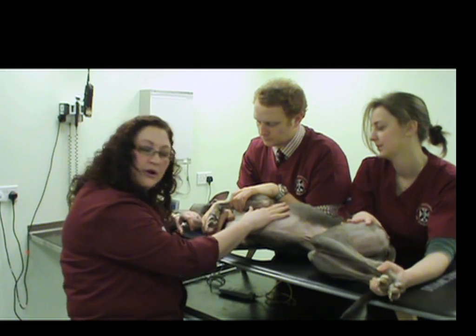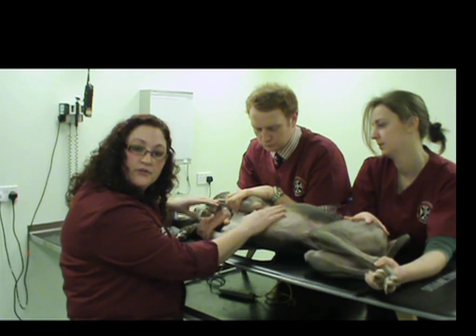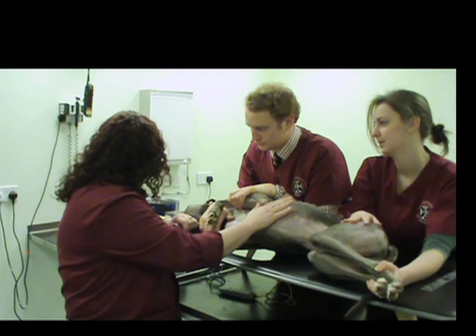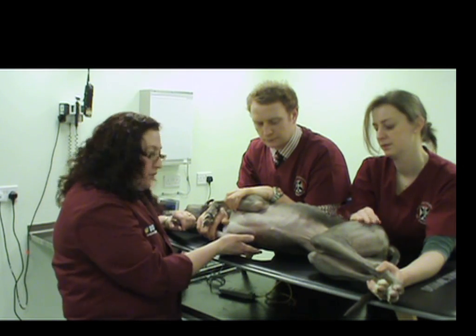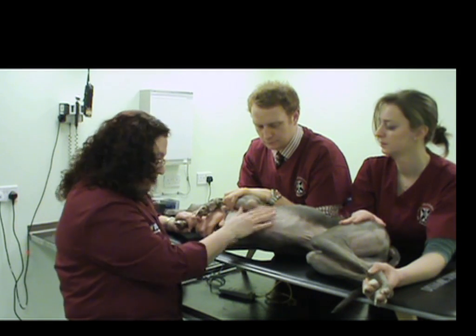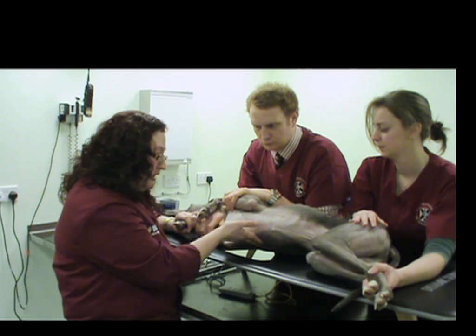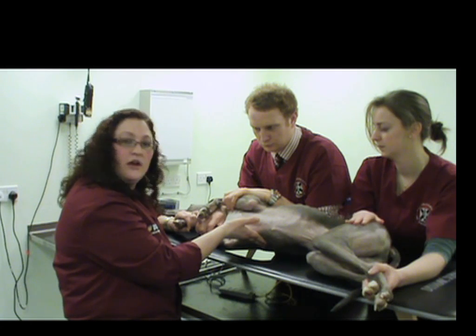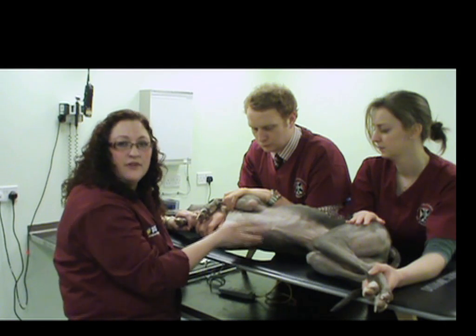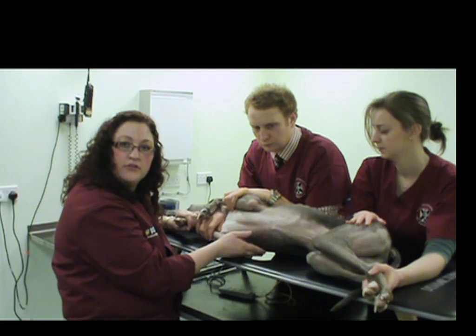It's very important to remember that, as with any other form of ultrasound, clipping and patient preparation in terms of gel application will really help you to get the best possible image. Today we will be going from the right side. What we will actually do is clip over the apex beat — our patient has already been prepared — clipping a small square of about 2-4 cm over the apex beat, which will give you a good window into the heart. Applying ultrasound gel about 5 minutes before you're ready to get started will also help it soak in and ensure the best possible images.